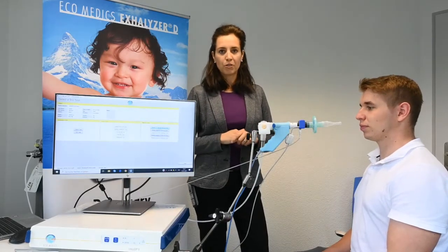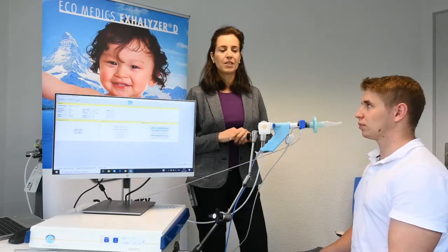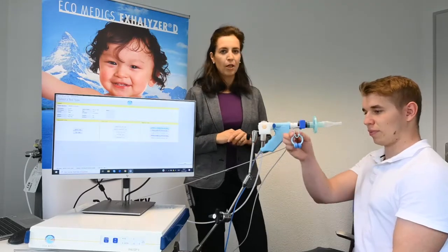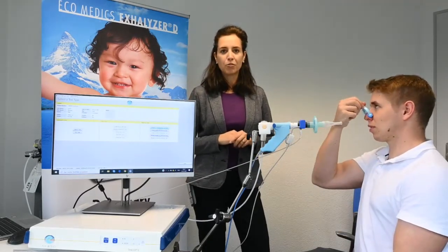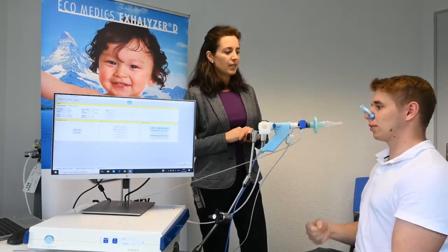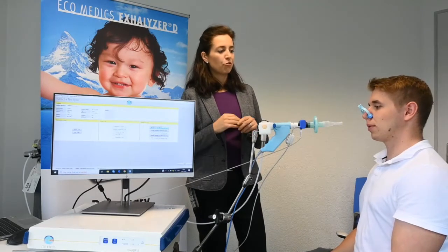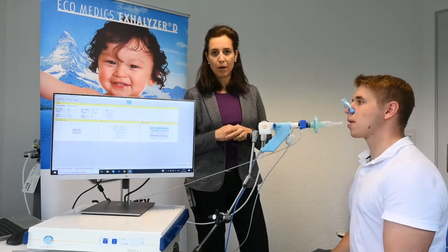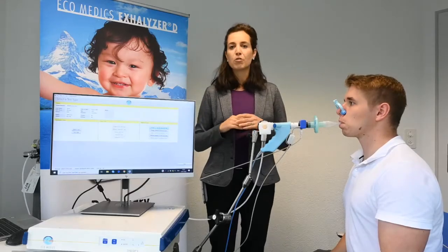Two points are important for the test. First, the subject should wear a nose clip so that there is no inhalation through the nose. And second, the subject should form a tight seal around the mouthpiece and breathe normally.